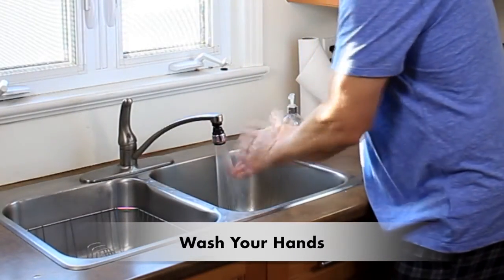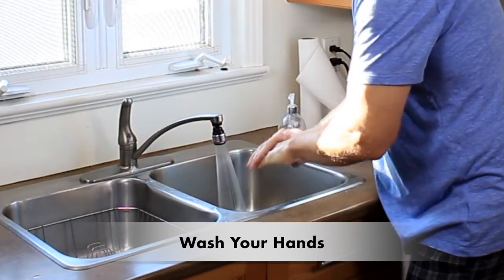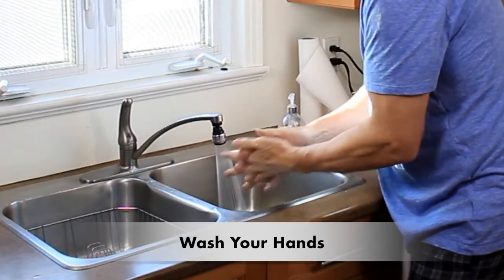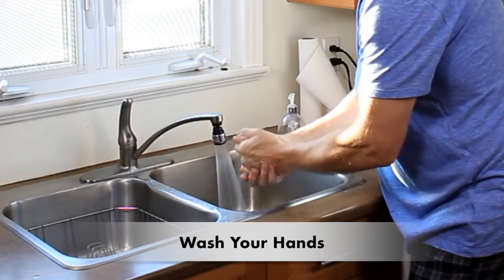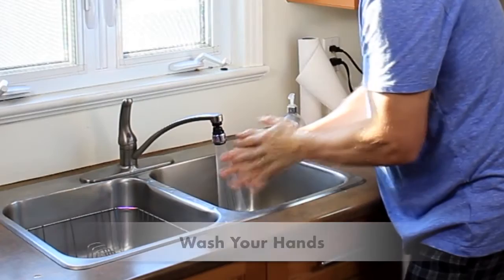You must always wash your hands before you touch your IV or supplies. You can use soap and water or hand disinfectant if your hands are clean. Scott's using soap and water. He's scrubbing the five areas on his hands: the top, the palms, the thumbs, the fingertips, and his wrists.